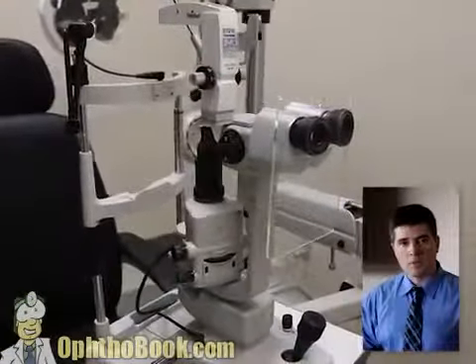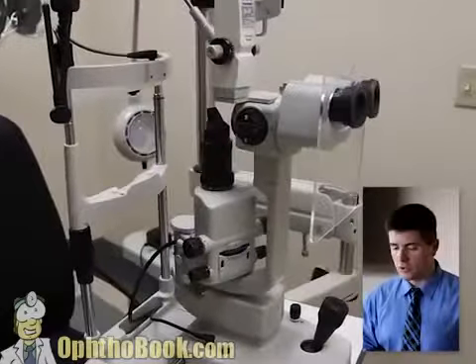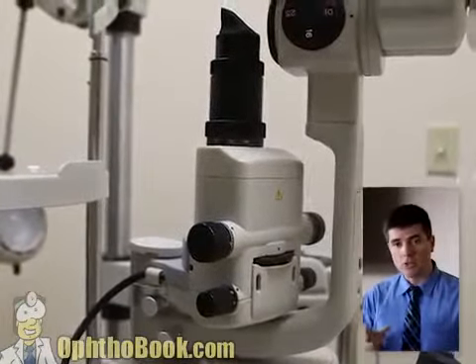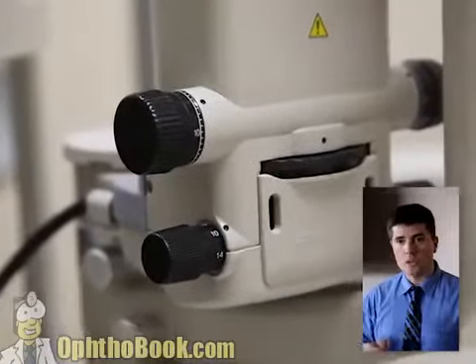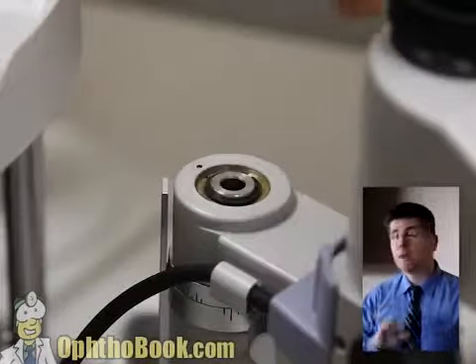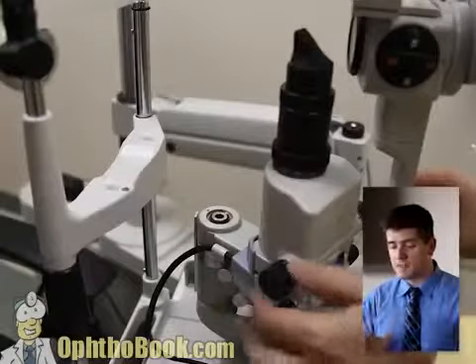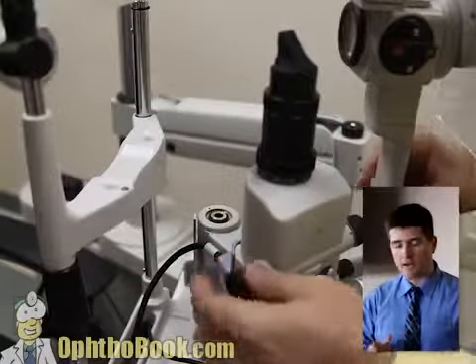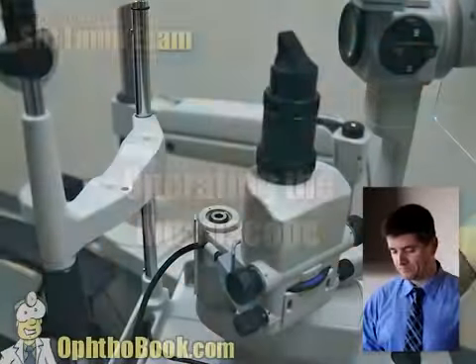This is the modern microscope that we use in all of our clinics. This is a version by Topcon, but many of the other manufacturers are making this style. The light is down below, which is nice, but all the controls are in one central location for controlling our light and our filters and our various settings. But no matter what microscope you use, they all have the same basic principle, and that is that there's a common rotational pivot point that they all work around in order to focus on the eye.